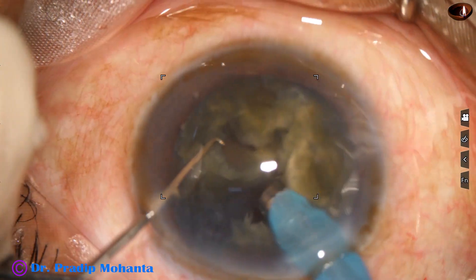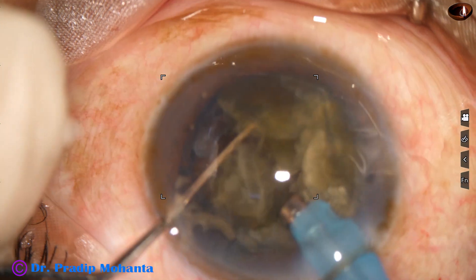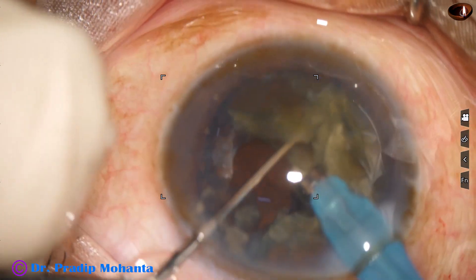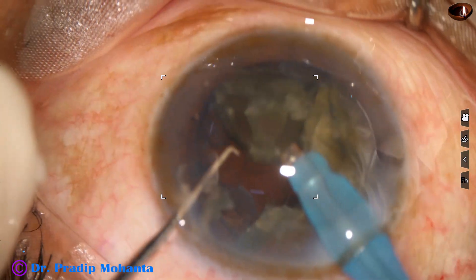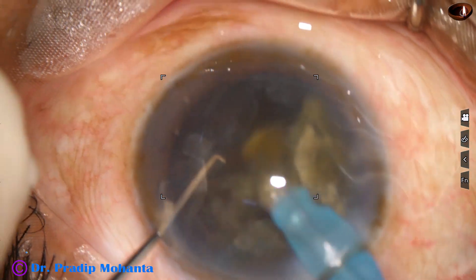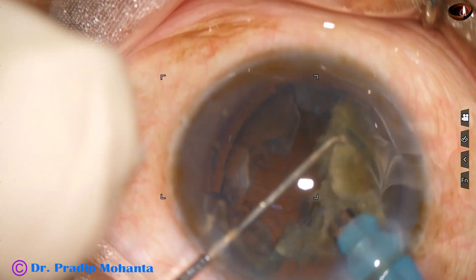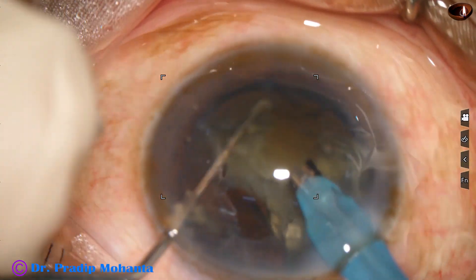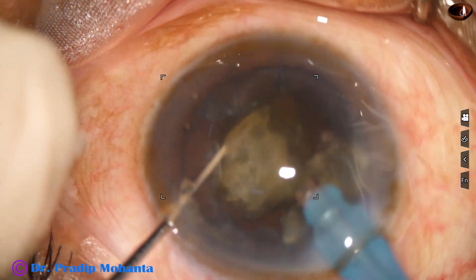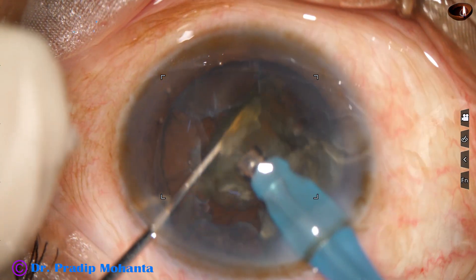Each nuclear piece is tilted and emulsification is started from the apex of the triangular nuclear pieces. Ultrasonic energy used in this case is 70%. Flow rate is 45 ml per minute and vacuum is 450 mmHg.